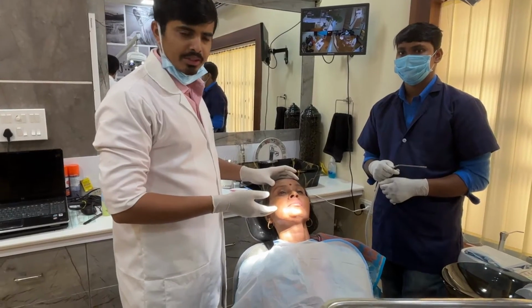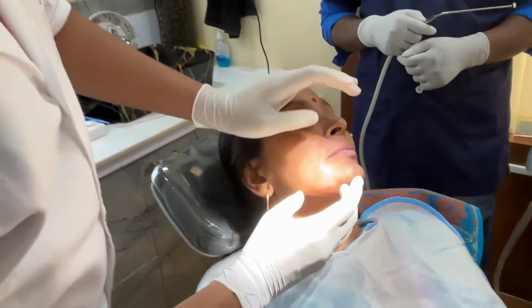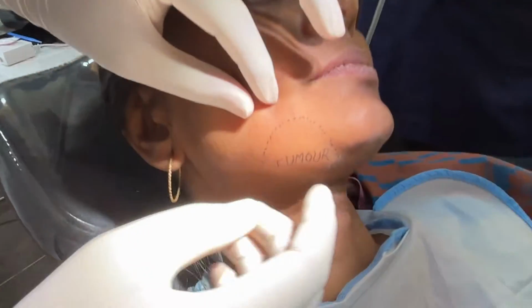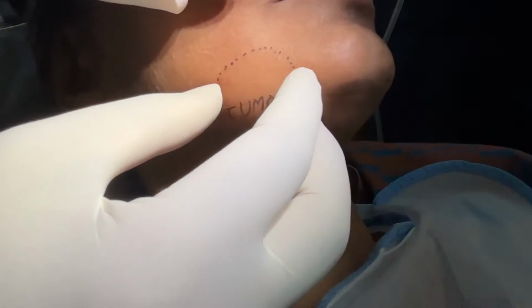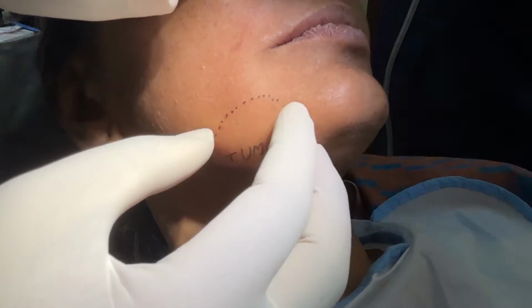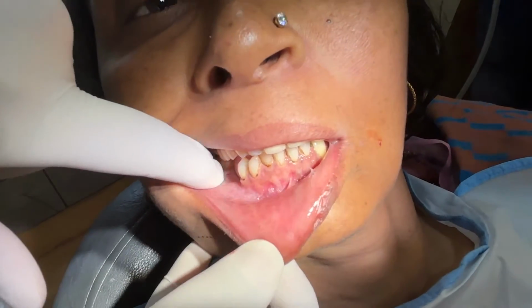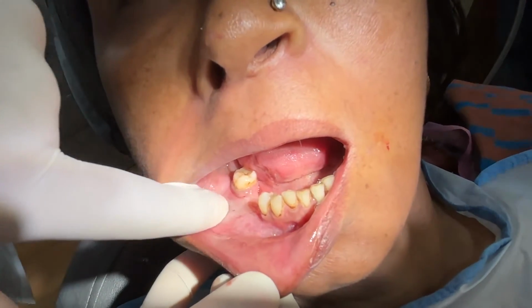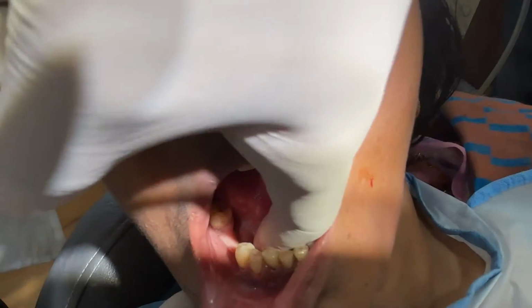So we have this patient who has a tumorous mass on the right side of the mandible. I have marked the area, as it cannot be visible properly through the skin. This is the area I can palpate. This is a tumorous mass, and intraorally there is buccal cortical expansion, and also lingual expansion.